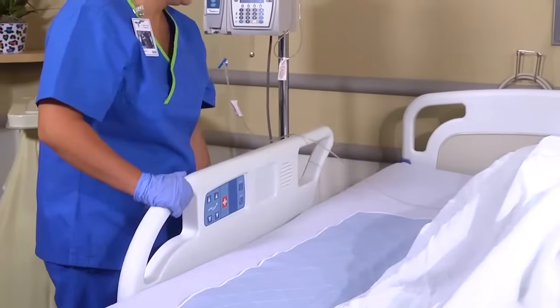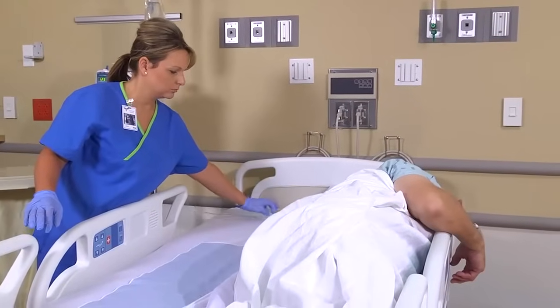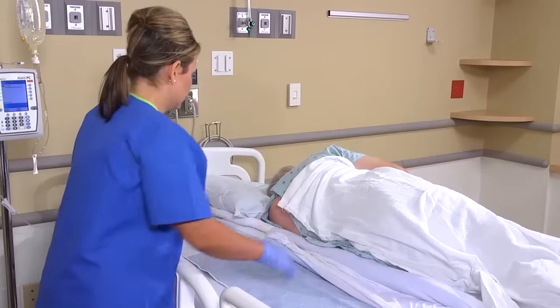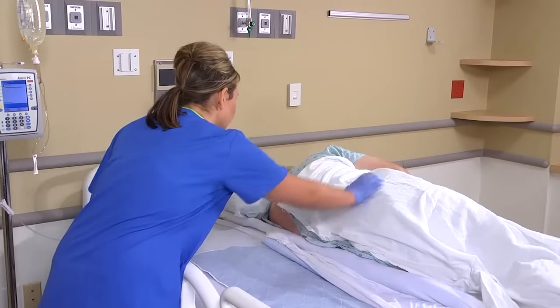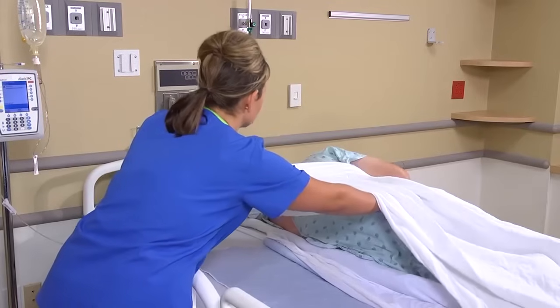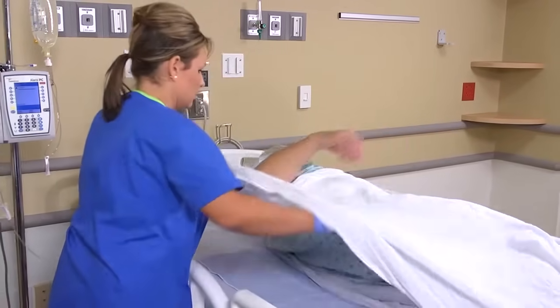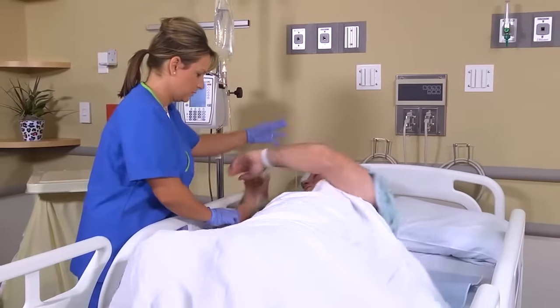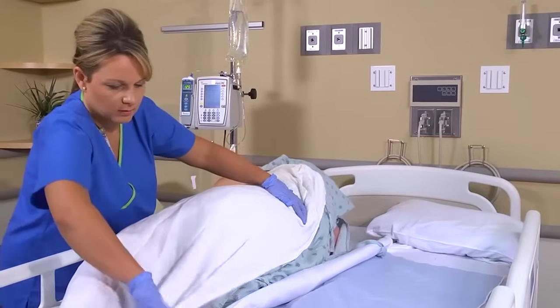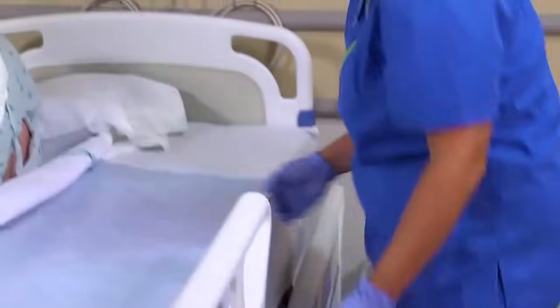Now raise the side rails and ask the patient to turn toward you. Explain that he will be rolling over layers of linen. Okay, Mr. Hayes, I'm going to have you roll towards me — and you're going to feel a big hump. Help him roll toward you, making sure he turns slowly and keeps his body correctly aligned. Move to the opposite side of the bed and lower the side rail.